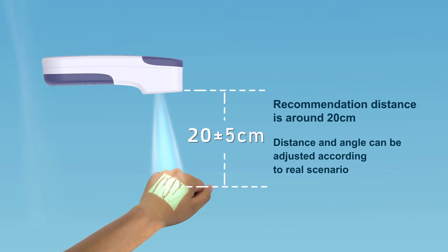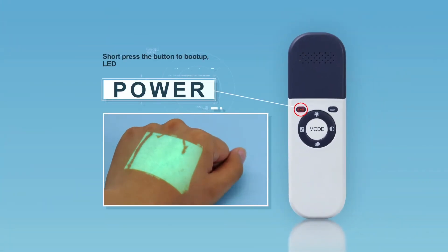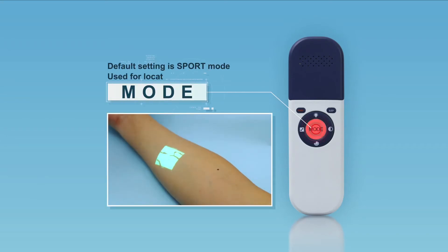Check that characters in the projected image are clear. To power on the VeinFinder, short press the power button. Short press the button again and the device will turn off.